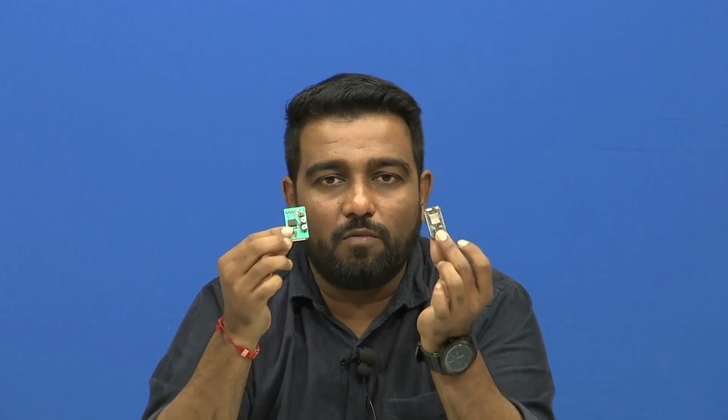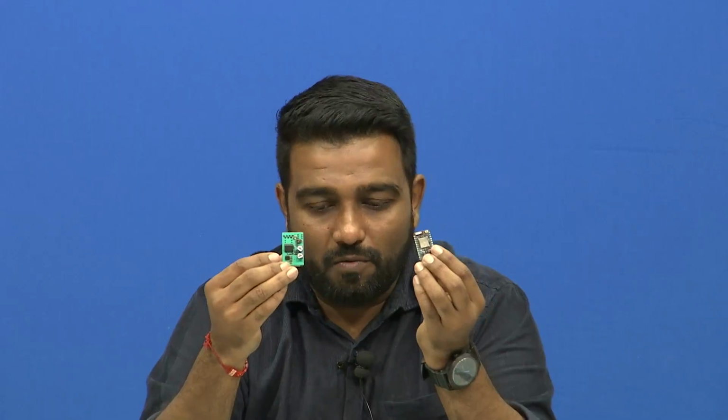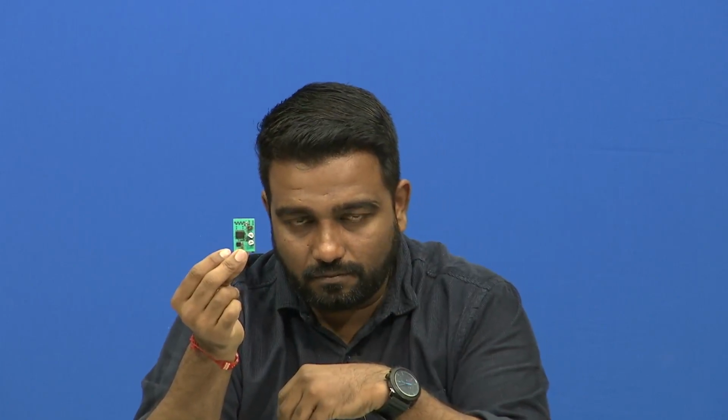So, there are ways of using the EEG signal and using the electronic signal conditioning circuit. Finally, you are talking about this thing. When we talk about the input stage amplifier, broadband amplifier, gain controller, and the final band pass filter, we are all talking about this one only. That is it. To transmit the signal, we can use this one. If you do not want to use it directly, wire transmission is also possible. We can use wire with a microcontroller, but there are several options.